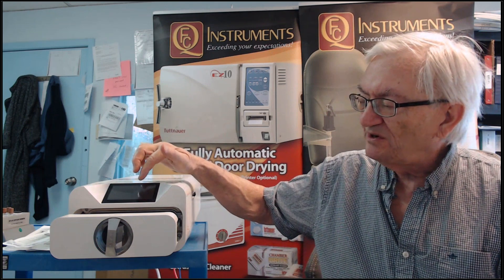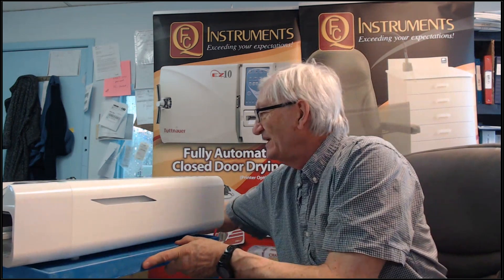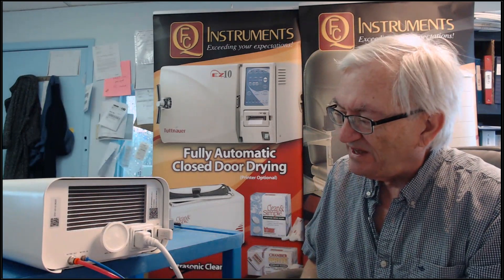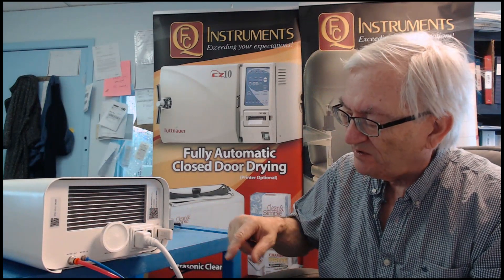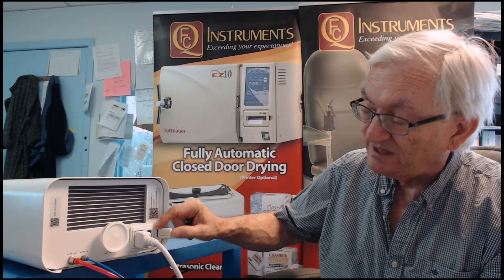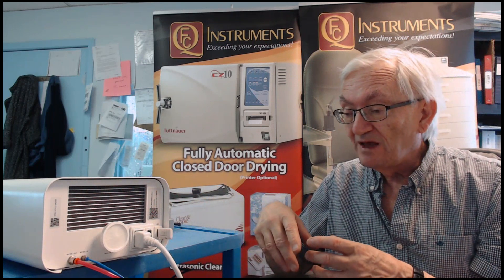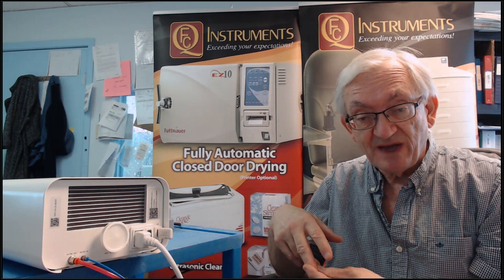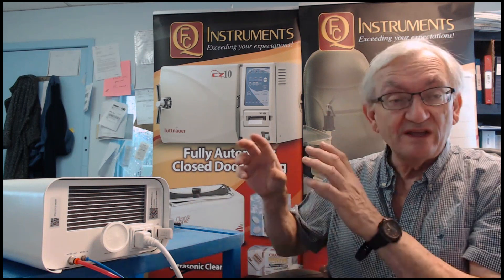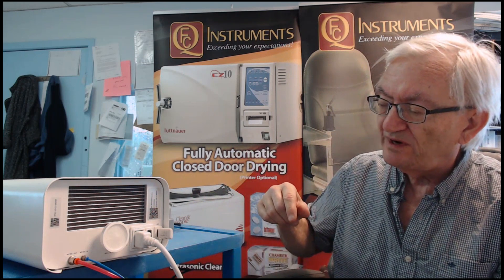When you turn it on, I'm going to move this around to show you all the cool features. They're actually on the back: the power cord, the on/off switch, and your USB stick that records everything. The USB stick also has an installation video, a copy of the manual, a copy of the warranty, and it keeps all your cycle reports — plus the software you need to read those cycle reports.